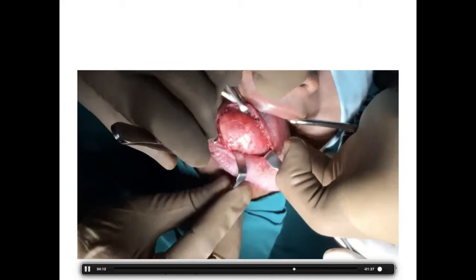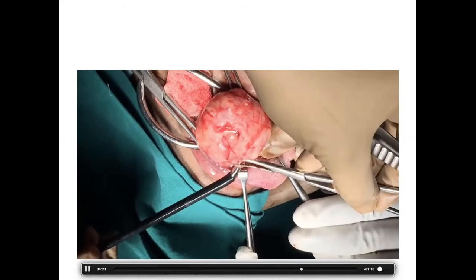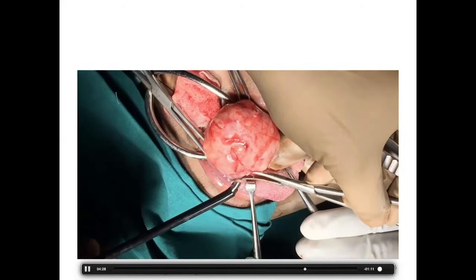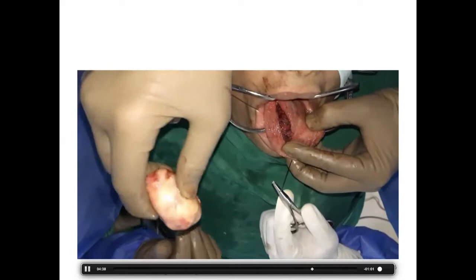For the many mid-sized capillaries over this lesion we used the coblator to achieve complete hemostasis. We separated the lesion — a well-capsulated lesion — completely from adjacent tissue and removed it.